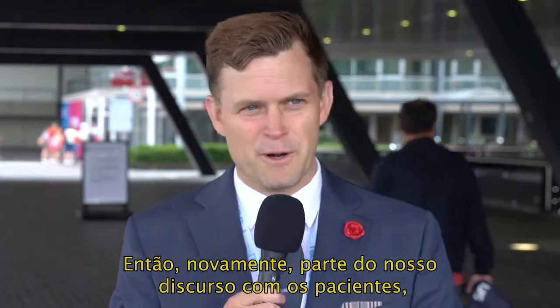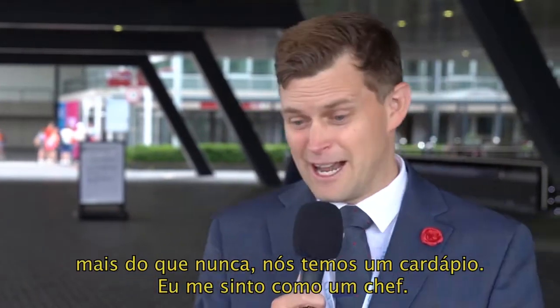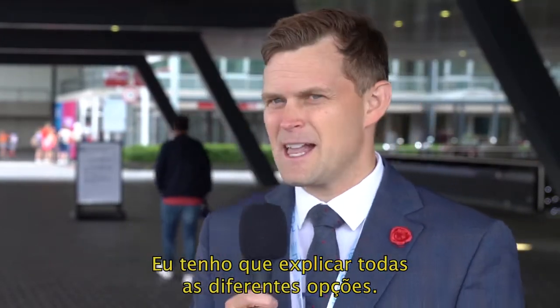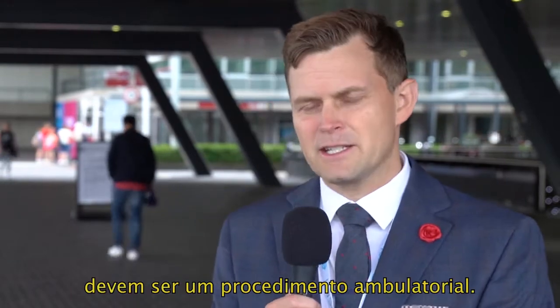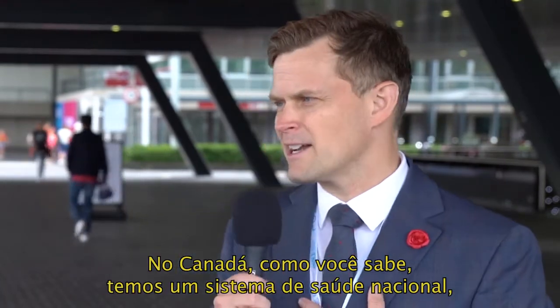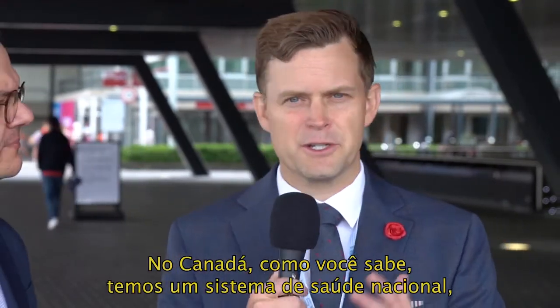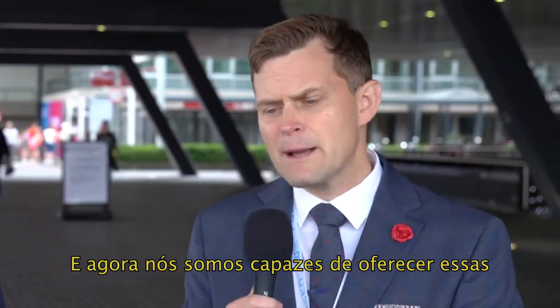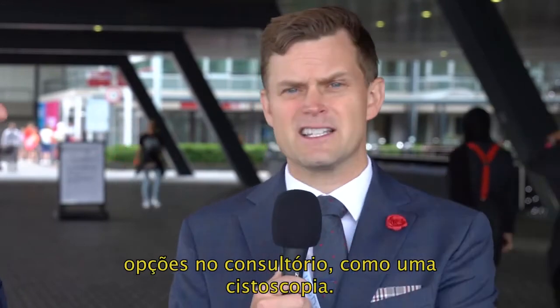So again, part of our much more discourse with our patients now, more than ever, we have a menu of, I feel like a chef, I have to explain all the different options. And with MIST, again, it's an office-based procedure. So in Canada, we have a healthcare system which is all nationalized, so patients wait long for their surgeries. So now we are able to offer something that's in the office, kind of like a cystoscopy.